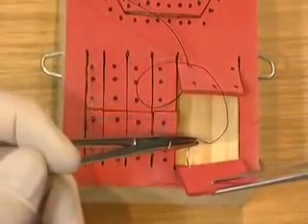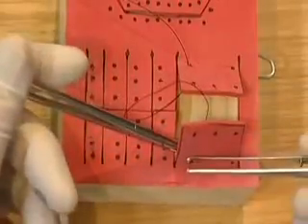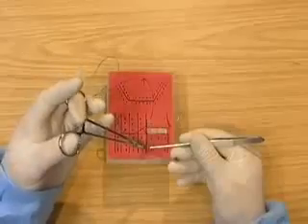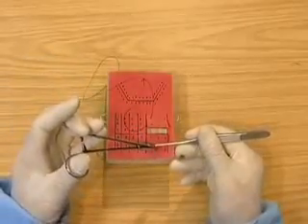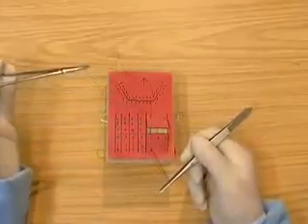Picking up the needle with the tissue pickups, unlock the needle using reverse grip, pull the thread through.